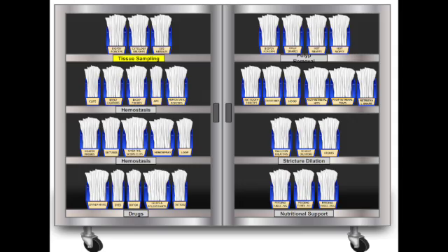Primarily for varices, right? Especially esophageal. That's its main job, yes. Treating variceal bleeding, particularly in the esophagus, sometimes gastric varices near the cardia, too. It deploys little rubber bands to strangle the varix. But it's used for other bleeds, too. Oh, yes. Increasingly versatile, it can control bleeding from hemorrhoids. It's also used for some arterial bleeds, Mallory-Weiss tears, Dieulafoy lesions, post-polypectomy bleeding, diverticular bleeding, and even for diffuse capillary bleeding, like in watermelon stomach or AVMs.